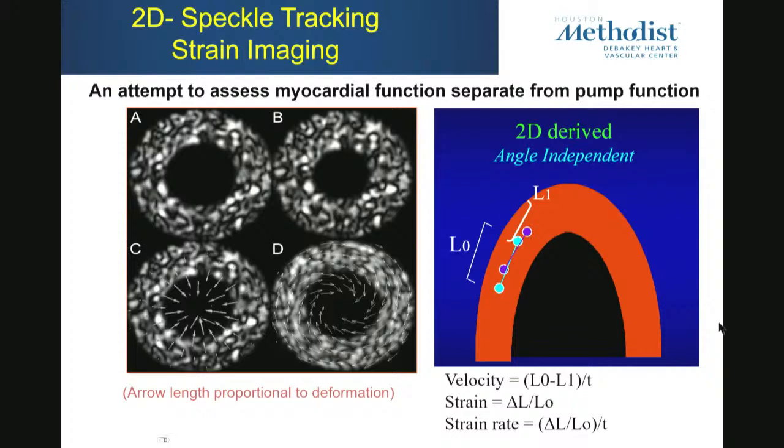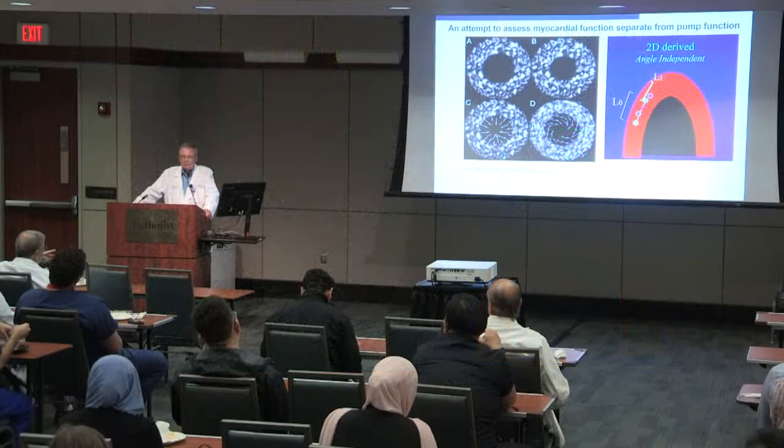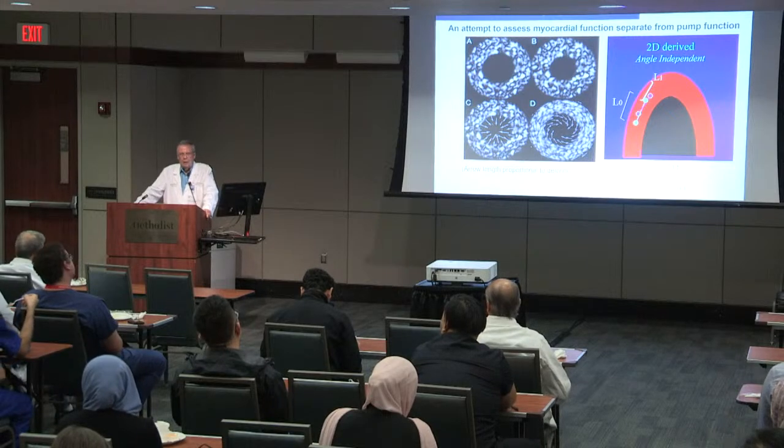The problem with the 3D is nowadays we gradually adjust it to trace the endocardium further in and ignore the trabeculations. The automated 3D contouring of the endocardium is not yet adjusted to that. So you're going to have to adjust it manually, and you'll get bigger volumes, and you'll still get a decent EF.